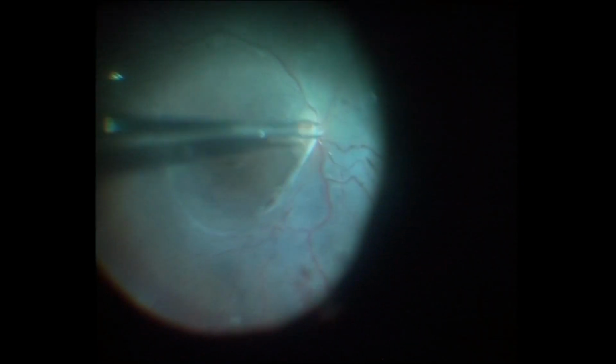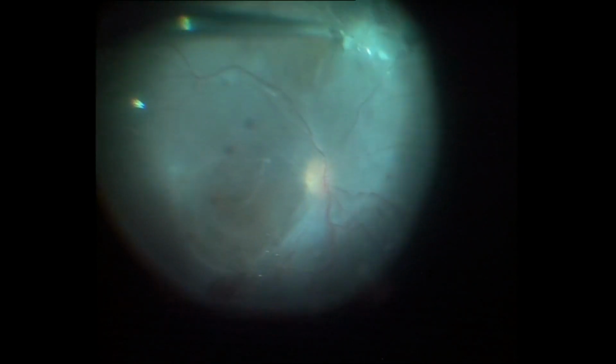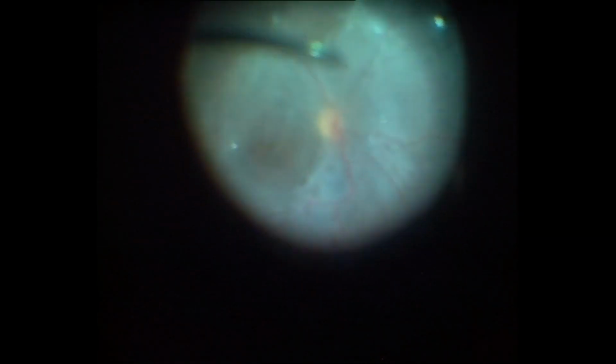Persistent posterior hyaloid was completely lifted up from the retinal surface using the forceps. This was followed by removing the hyaloid membranes using the vitrectomy cutter. Once the vitreous was removed, the surgeon created an inferior retinotomy.